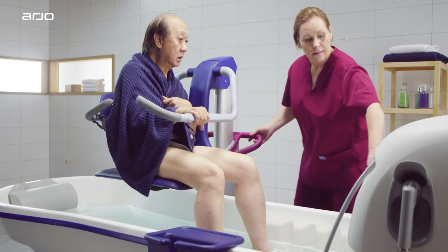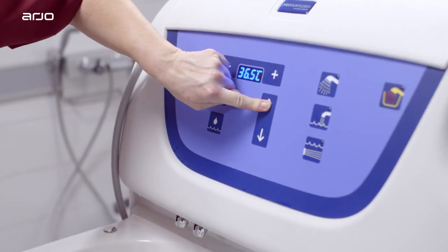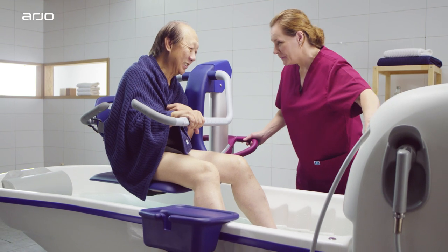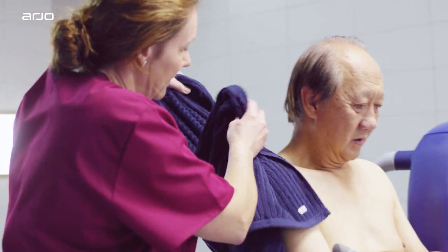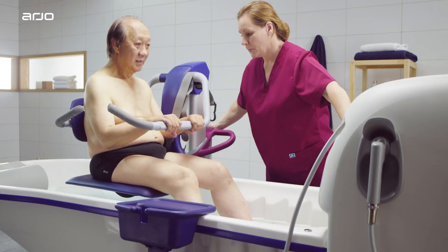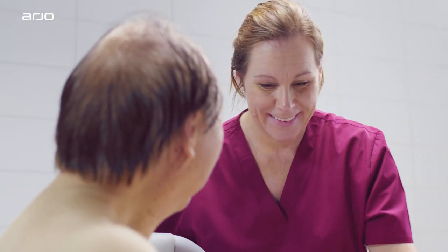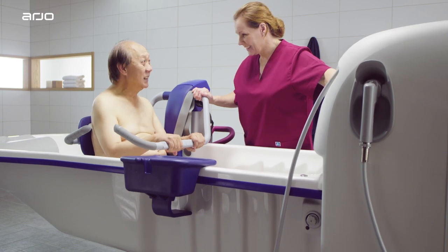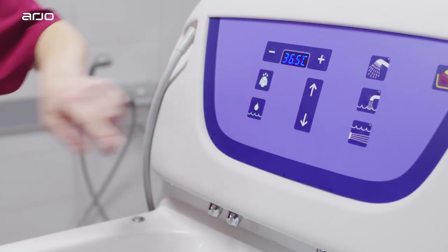Ensure the lift is docked against both legs and the rim and activate the brakes. Adjust the lift to a comfortable, ergonomic working height and find a position that allows for comfortable interaction. Once the chair is at the right height, raise the bath so that the Alenti rests on the bottom of the tub. Take care to ensure that no parts of the resident's body become trapped between the bath and the seat. The combination of the Alenti chair and the Rhapsody bathing system allows for as much of the resident to be lowered into the water as possible.